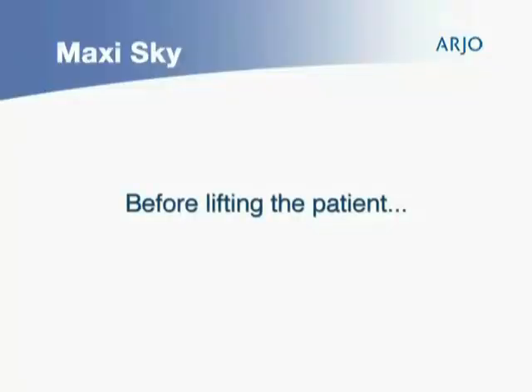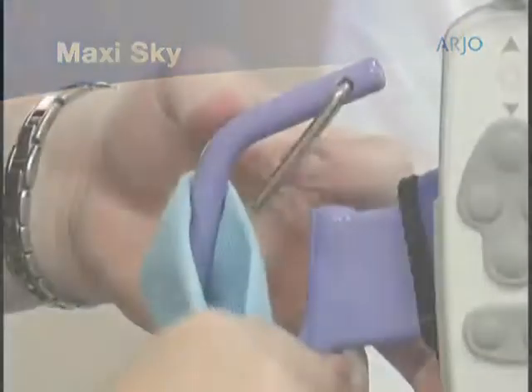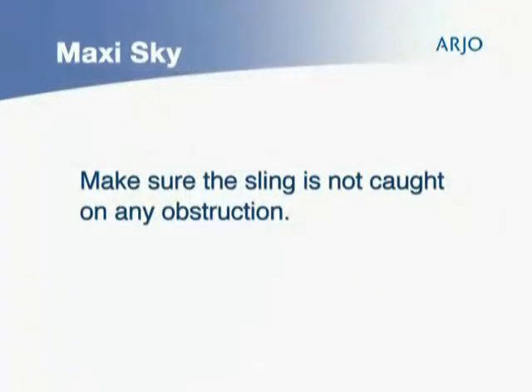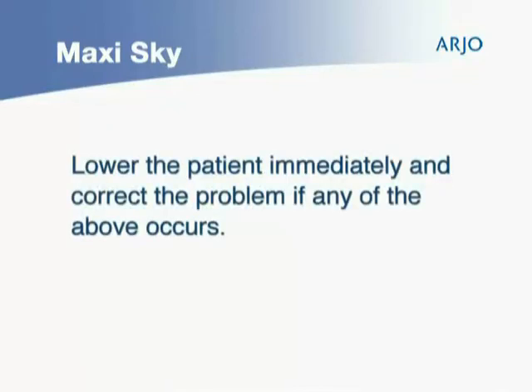Before lifting the patient, first make sure that all straps are attached to the spreader bar. Second, make sure the patient is comfortable. Third, make sure the sling is not caught on any obstruction — wheelchair brake or arm of the chair. If any of the above occurs, lower the patient immediately and correct the problem.